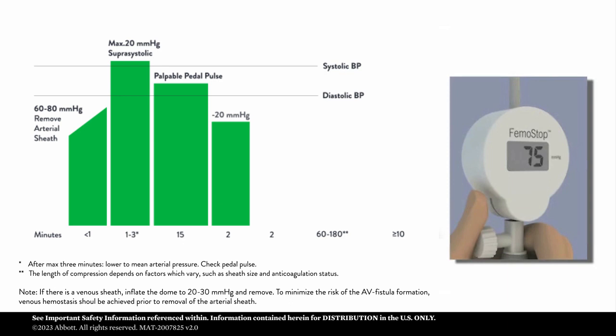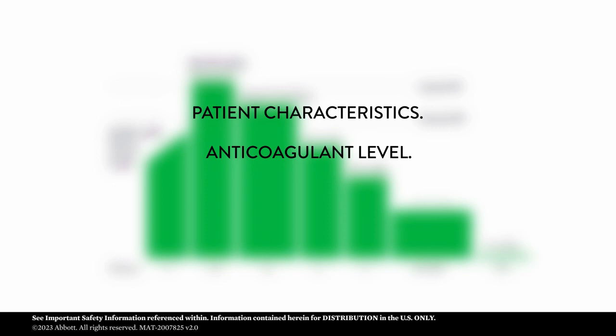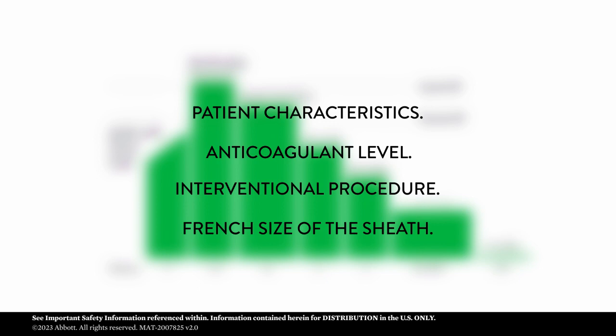After approximately 15 minutes, lower the pressure by 20 millimeters of mercury every 2 minutes or according to hospital protocol. Continue maintenance pressure according to your facility guidelines. Time to hemostasis differs depending on patient characteristics, anticoagulant level, the interventional procedure performed, and the French size of the sheath used.